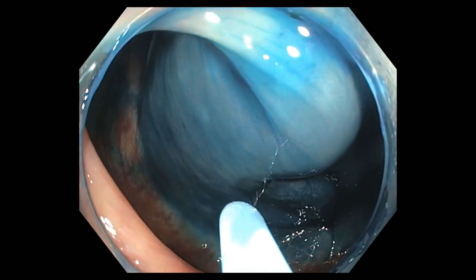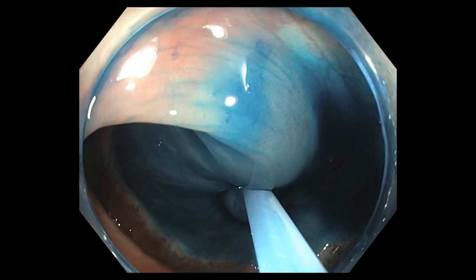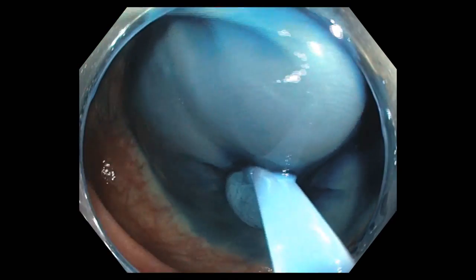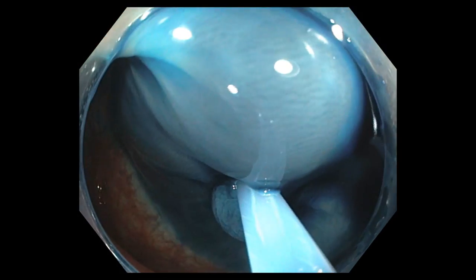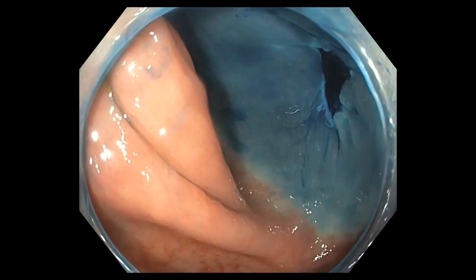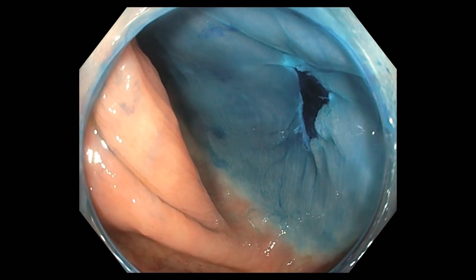Here we use a stiff wire snare to grab the lesion, attempting to grab both the lesion and a surrounding one to two millimeter margin of normal tissue. Importantly, we carefully inspect the margins to make sure that we have a complete resection.